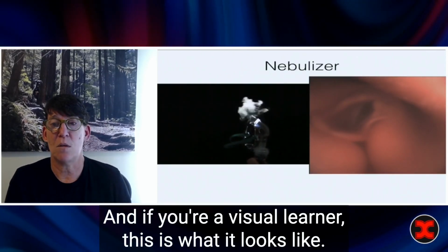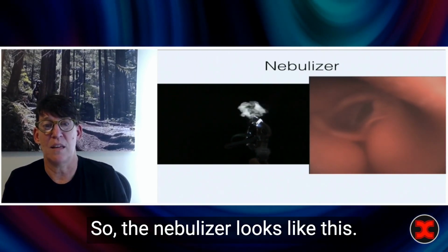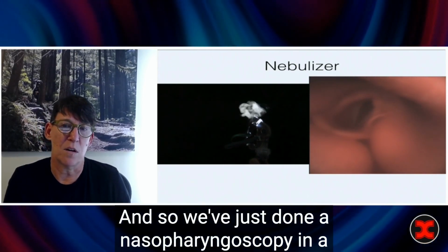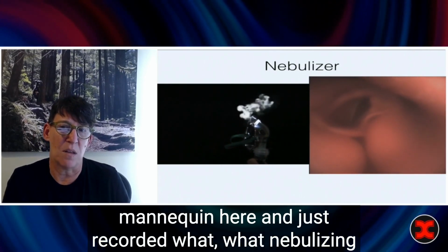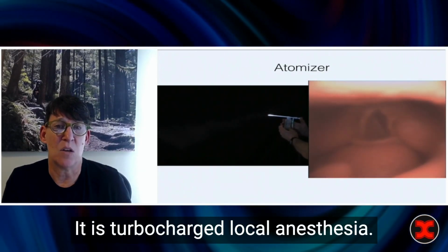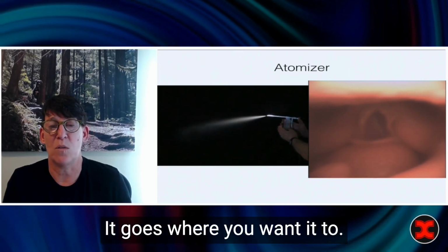And if you're a visual learner, this is what it looks like. So the nebulizer looks like this. It's small particulates, and that's what it looks like above the airway. We've just done a nasopharyngoscopy in a mannequin here and just recorded what nebulizing looks like in a mannequin. Atomizing looks like this. It is turbocharged local anesthesia. It goes where you want it to.